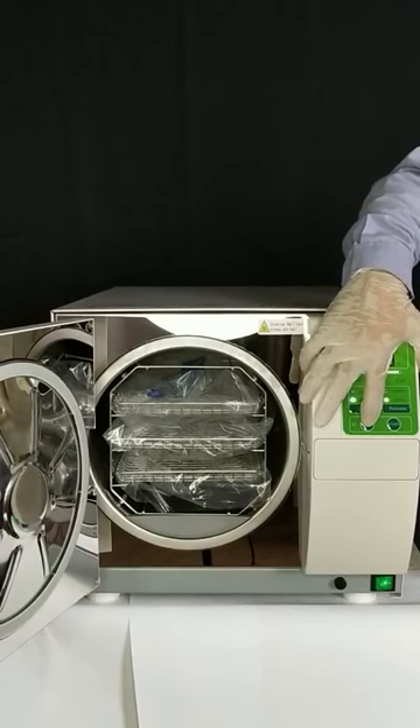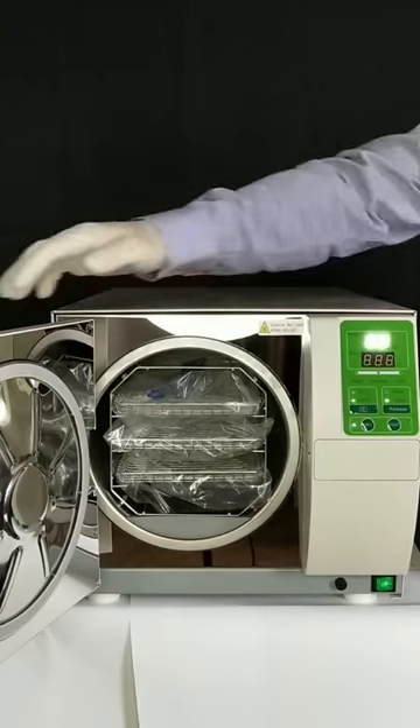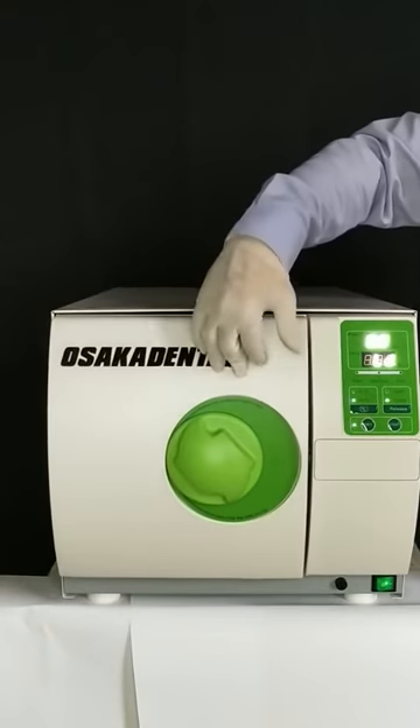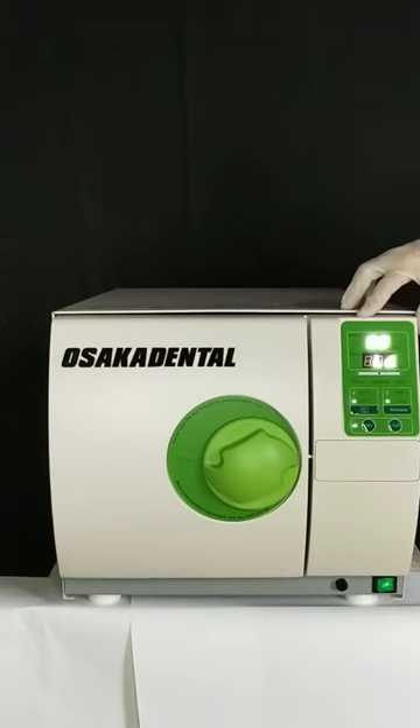This equipment has two drying function options, automatic and manual. The user can choose their best convenience to set its time.